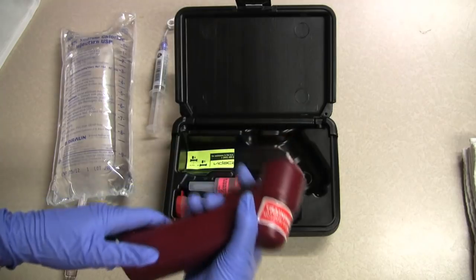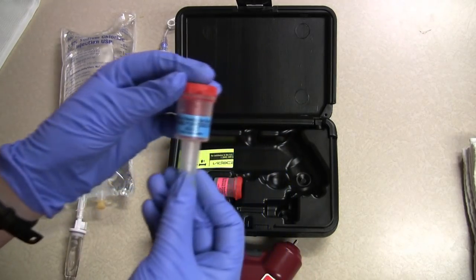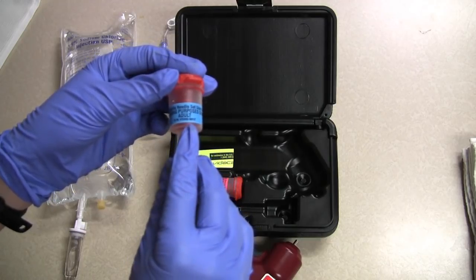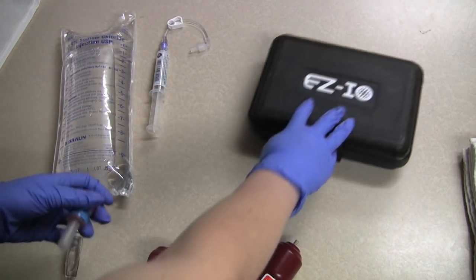So that works. Good. I'm going to pick an adult size needle. If your patient has excessive tissue at the insertion site, they do come a little bit longer.